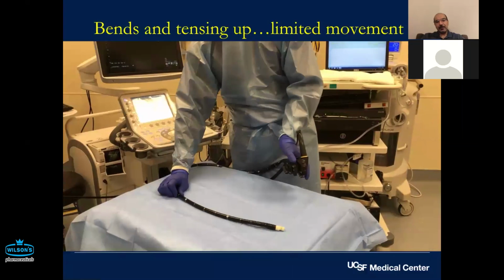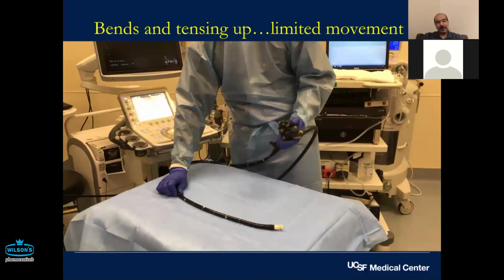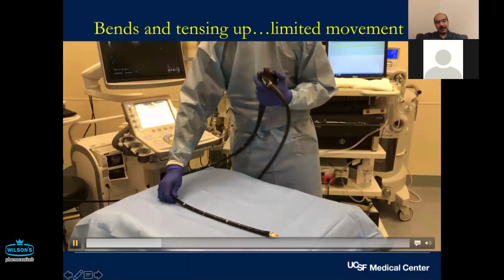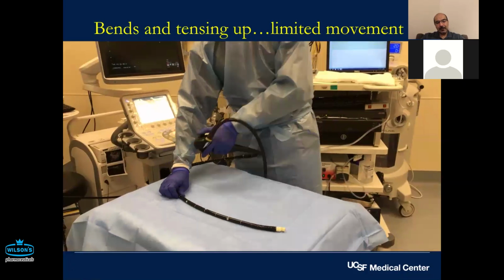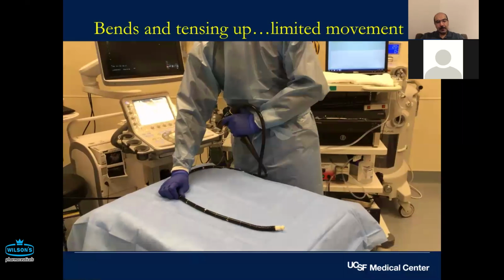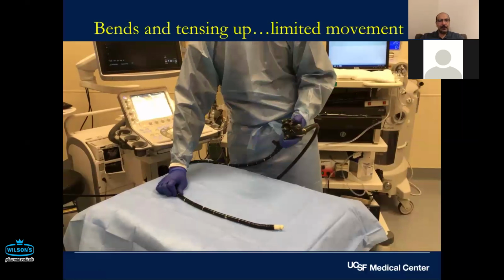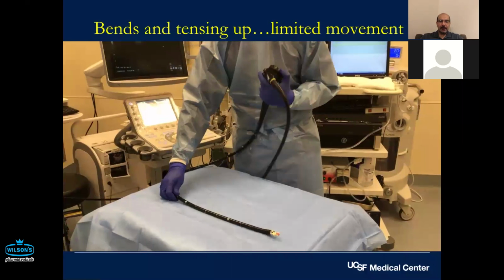Your left hand's doing a lot of work, but you're so tense with your right hand that your ability to scan that tissue that you want to visualize gets very compromised. So fluidity in your movement and using it as straight as possible, working loosely actually helps in diagnostic EUS.